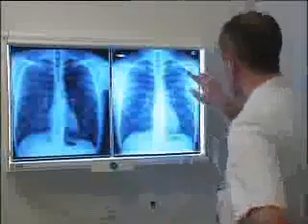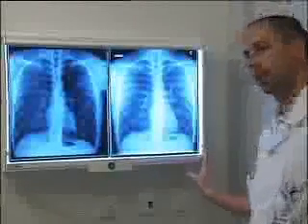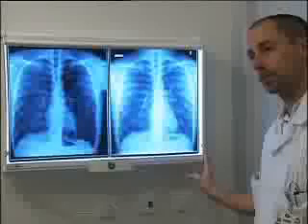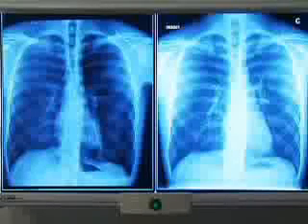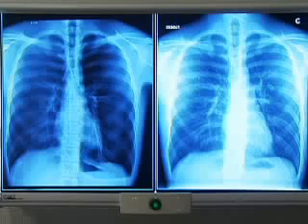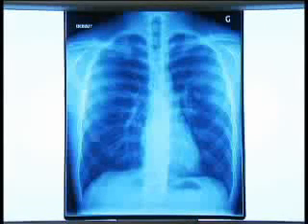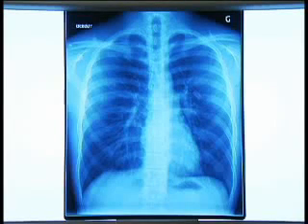When needle aspiration is successful, the patient's symptoms will improve, and no pneumothorax or only minimal residual pneumothorax should be visible on the post-procedural chest film. Most patients are ready for discharge approximately 6 hours after the procedure, if a second post-procedural chest radiograph shows no indication that the pneumothorax has reappeared. The timing of patient discharge will vary according to the institution.